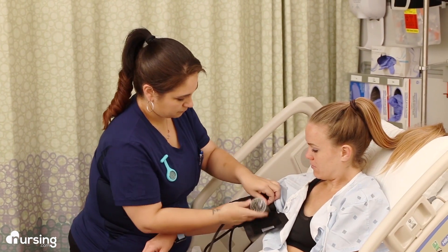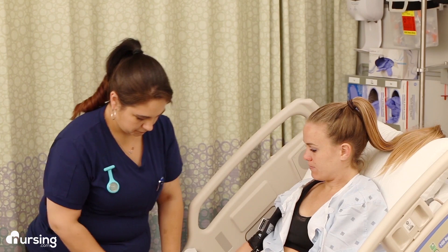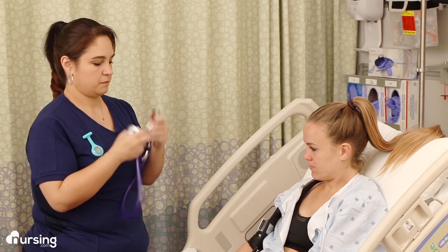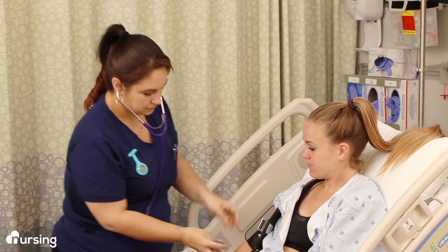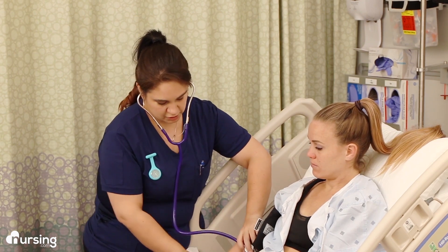Now you can position the meter, or sphygmomanometer, where you can see it. Then put on your stethoscope and place the stethoscope diaphragm over the brachial artery. Make sure that the valve on the bulb inflator is closed.